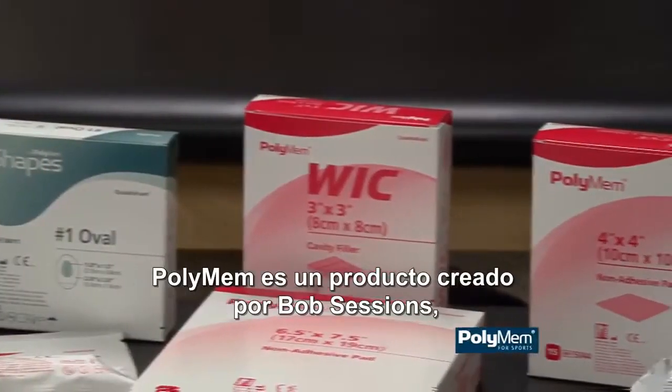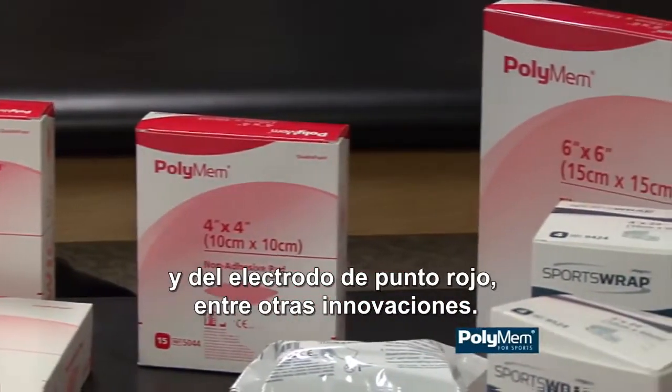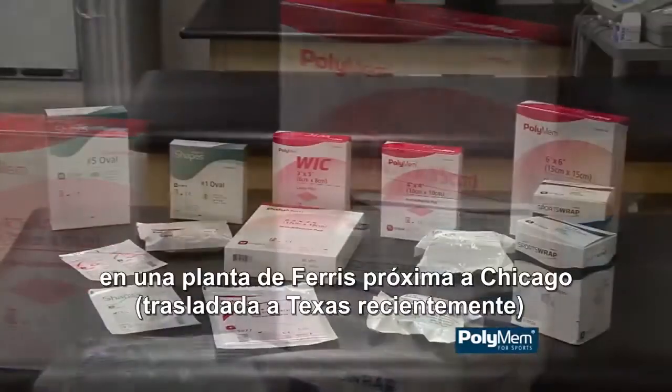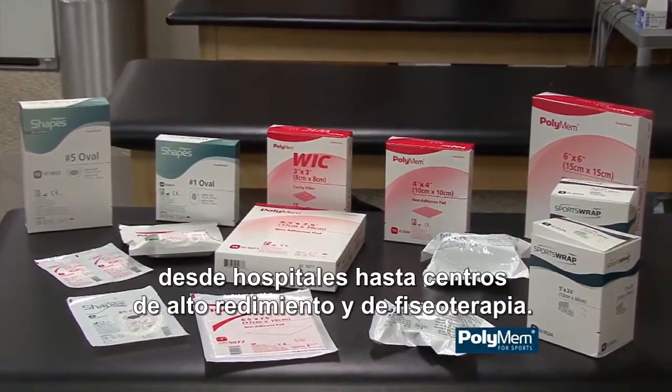PolyMem was created by Bob Sessions, who invented the first implantable pacemaker and the red dot electrode, among other innovations. PolyMem is made in the U.S.A., in Ferris' facility near Chicago, and is used worldwide in every setting from hospitals to athletic training rooms.